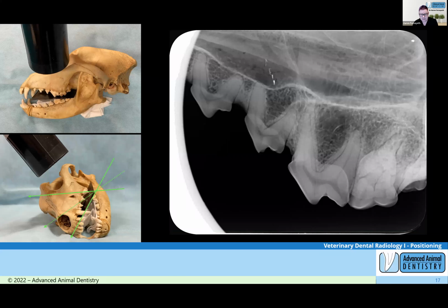You don't have to change them a lot. The patients and the tissues that we image don't vary a great deal, but you really do need to make sure that your exposures are good, because as relatively easy as it is to manipulate, if you have to digitally manipulate the images, you need to look at what you're doing in regards to the power. And specifically on the IM3 software, so if you're using a CR7, which I think is the most common software or processing that people are using.